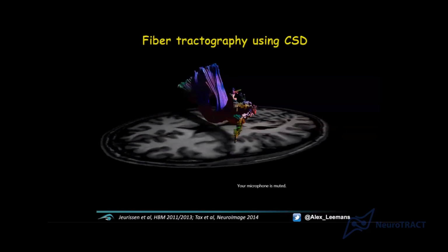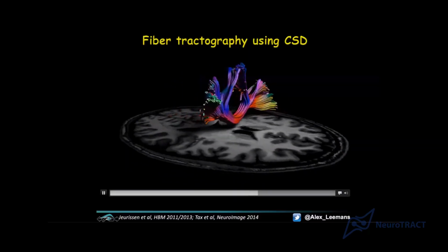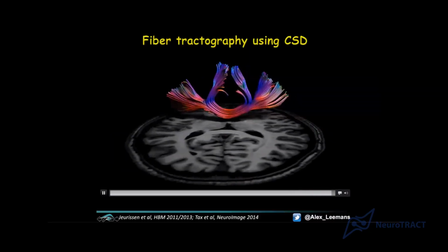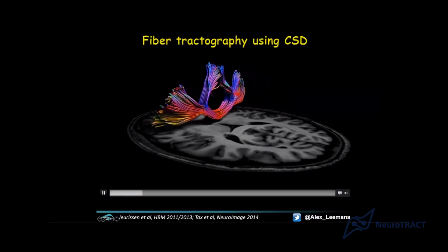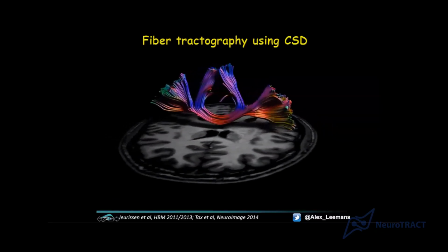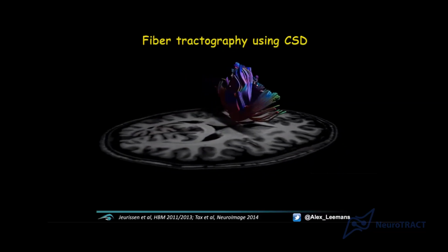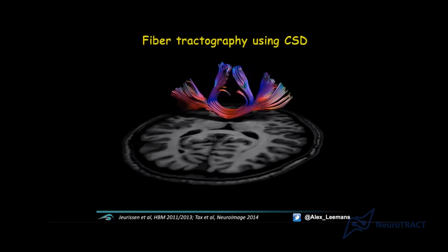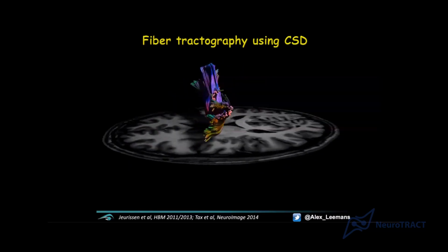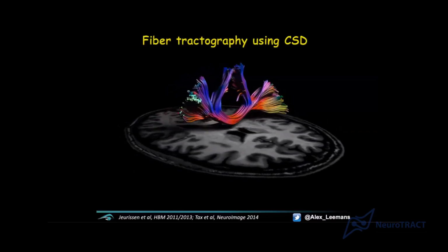So one thing that already immediately is striking is that it looks like you've got something similar to DTI, like this U shape, if you look at it coronally. But in addition, we also see these lateral projections, which we couldn't see before, because with DTI-based tracking, you would not be able to cross the corticospinal pathways going up. So it would kind of stop there. But in reality, they would actually cross those other pathways going to the lateral regions.